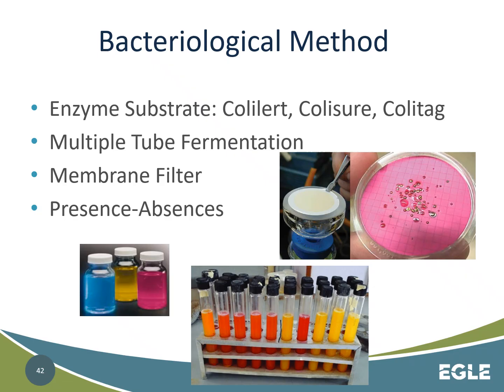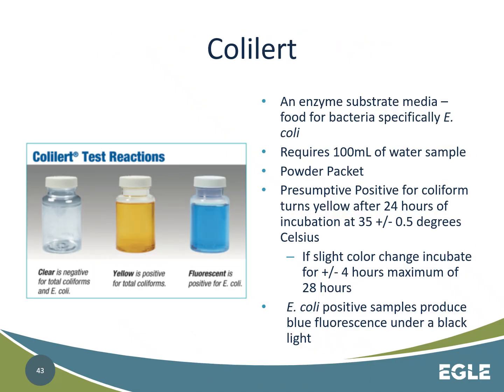Then we'll talk about multiple tube fermentation, membrane filter, and then presence-absence tests. All right. So the first one we're going to be talking about is Colilert.